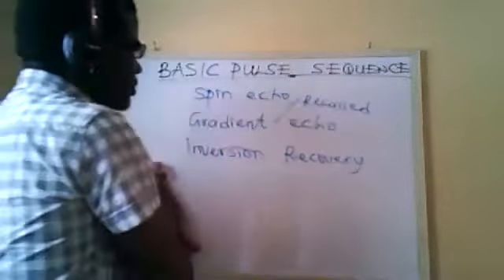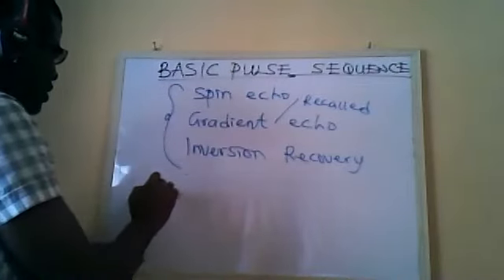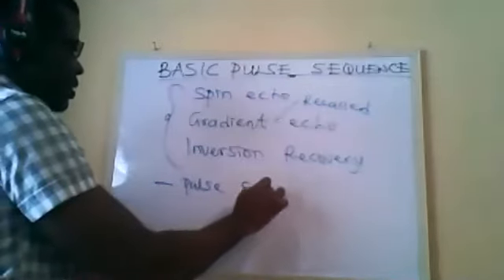And today, in doing this, we need to understand what we mean by pulse sequence.